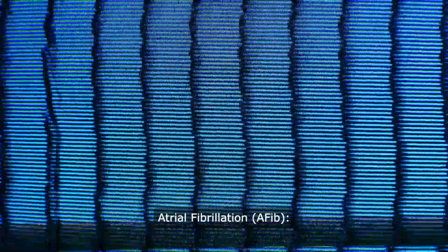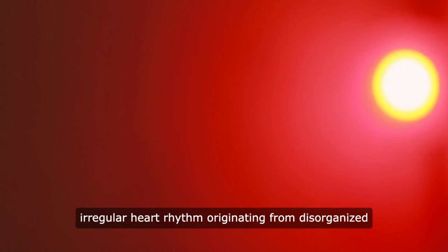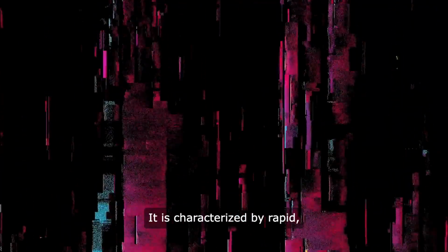Atrial fibrillation, AFib. ECG changes: absence of P waves, irregularly irregular RR intervals, and fibrillatory waves, F waves. Explanation. Atrial fibrillation is an irregular heart rhythm originating from disorganized electrical activity in the atria. It is characterized by rapid, irregular electrical impulses and ineffective atrial contraction.